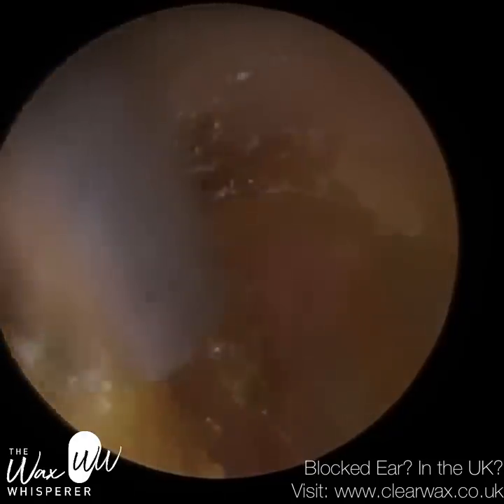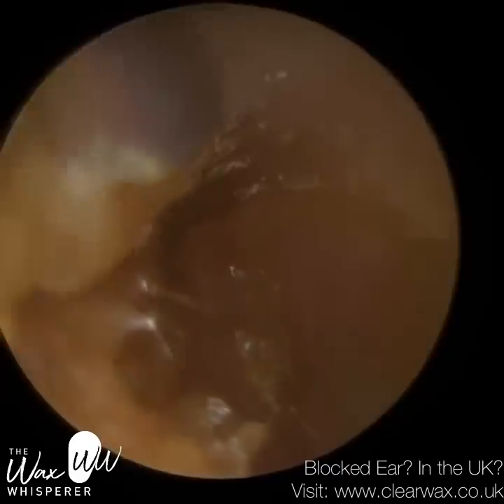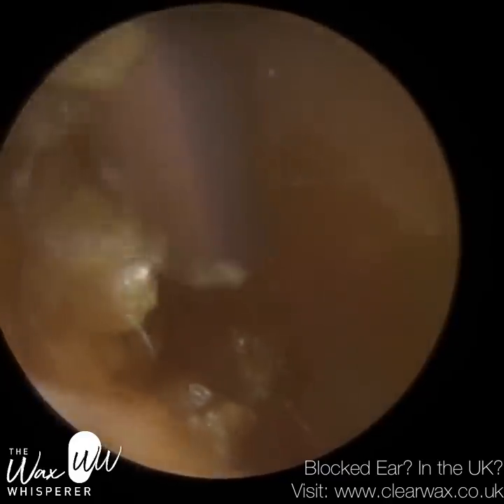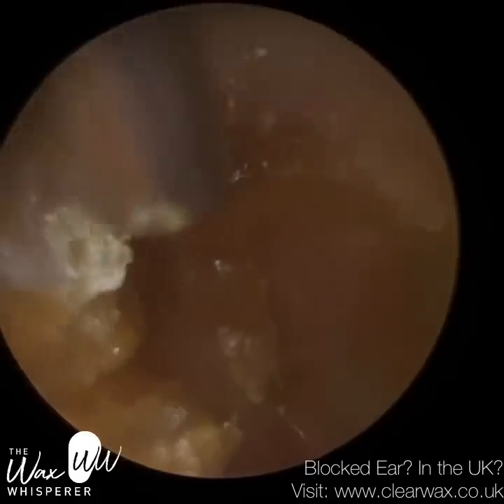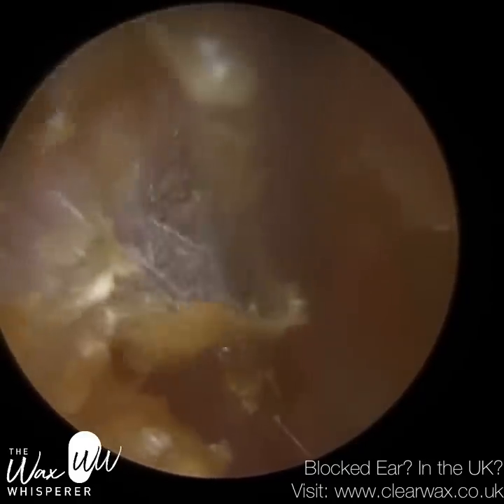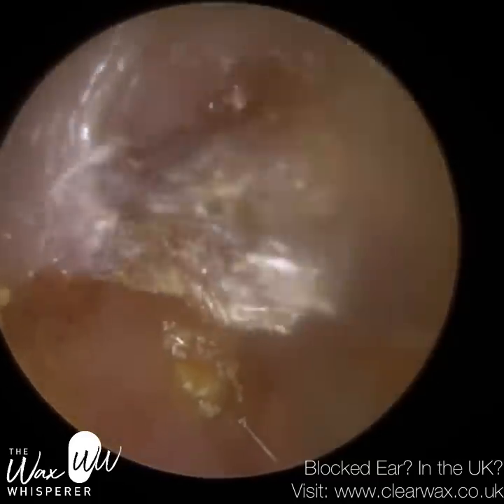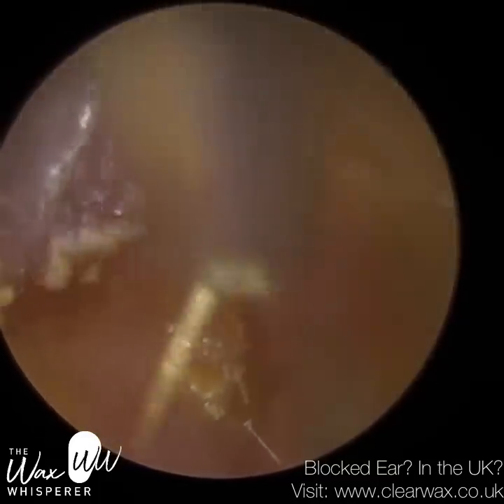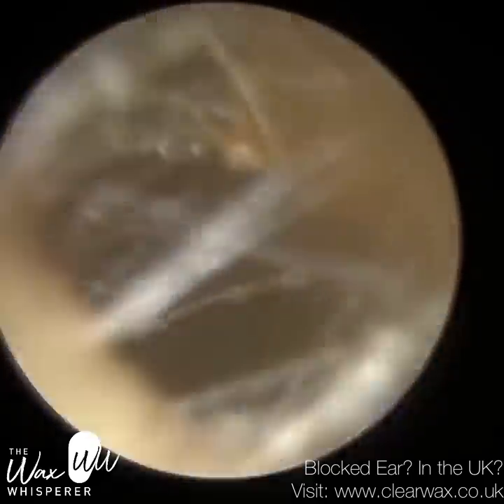The eardrum is now fully visible, and what I'm trying to do is peel away some of this soft wax and keratin off the side of the ear canal. The skin is not going to come away by itself, and the patient does report itchiness. In the majority of ears, as skin dies and sheds, it moves sideways out of the ear — we call that epithelial migration.